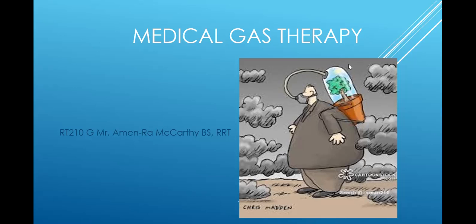And so now you gotta know which device relates to what low flow, right? You can't put somebody on a nasal cannula on 20 liters per minute, right? It doesn't fit that. There's a certain amount that you can do for each device. And you got to remember that. Like, for example, the simple face mask, when we get to that, is 5 to 8 liters per minute, okay? And so you got to know that. You wouldn't say I put them on a simple face mask for 2 liters. That's not going to work, okay?